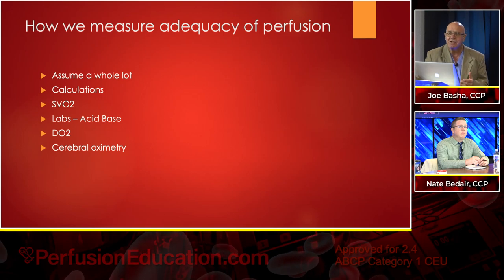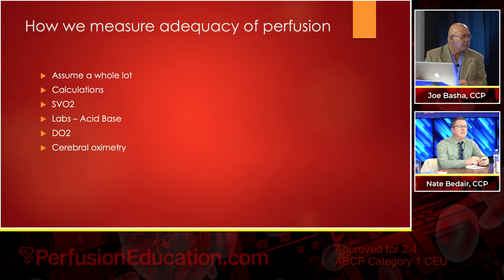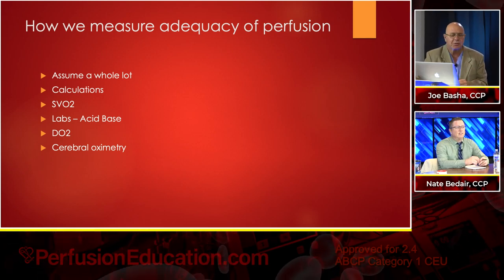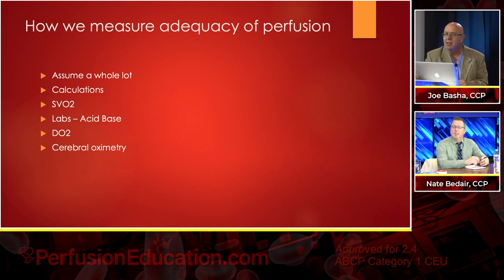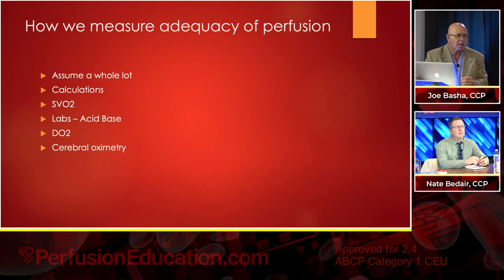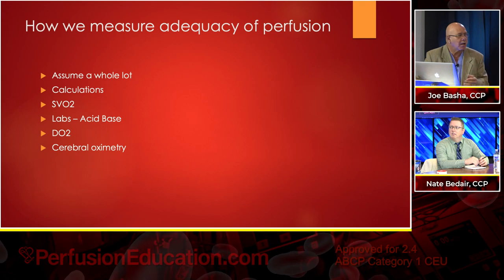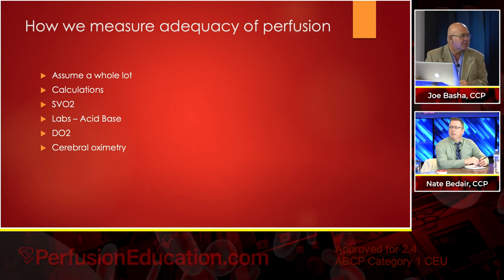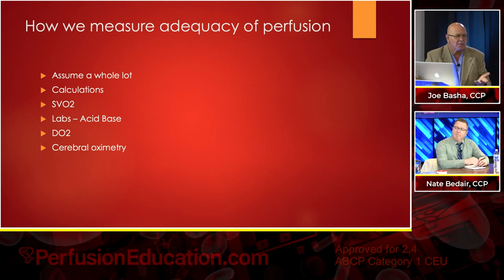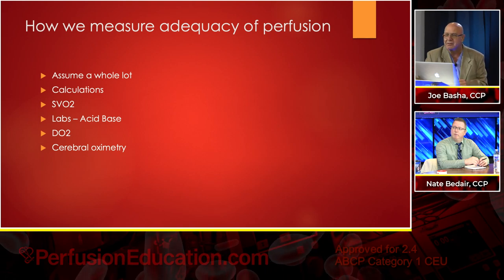So how do we measure adequacy of perfusion? Generally speaking, we assume a lot. We do sometimes some fancy calculations. We measure DO2, and we say, oh, we're good. We measure the SvO2, and we say our SvO2 is good. We assume from that we're delivering the right amount of oxygen. Of course, we don't really measure oxygen extraction rate, so we assume they're extracting the oxygen. The SvO2 is high because we're flowing a lot. Should we flow less? I really don't know the answer to that.